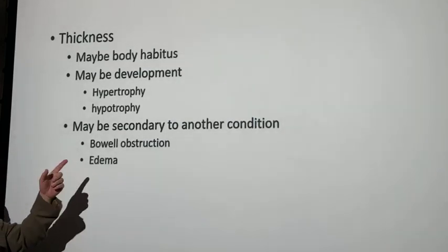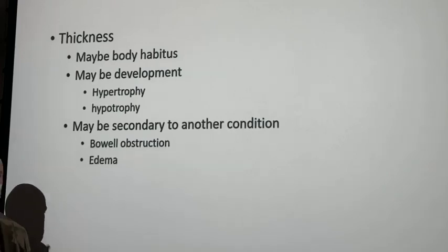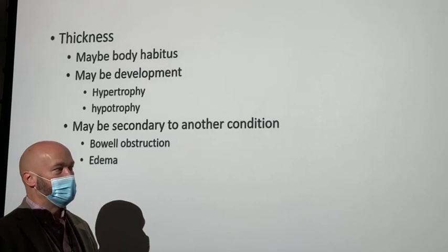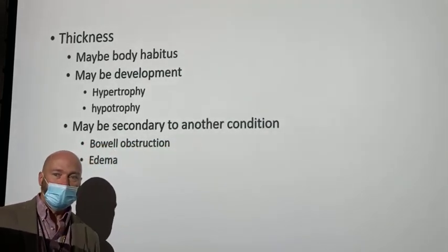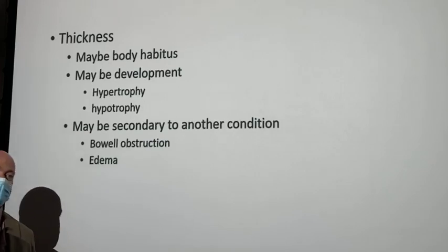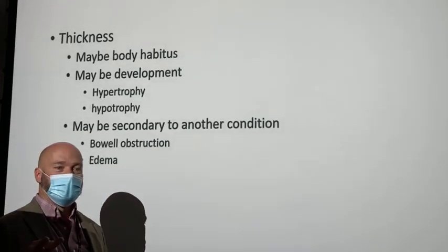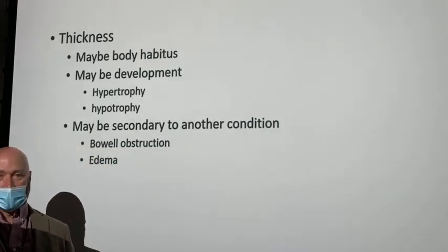But what your real indication is they've got a bowel obstruction is you walk into the patient's room, they've got an NG tube, so they've got a feeding tube in their nose. That's not enough. A lot of people have a feeding tube. Is that NG tube hooked up to suction? That's the second thing you should be looking at. Do they have an NG tube? Is number one. Number two, is it hooked up to suction? That's still not enough. Is that suction canister full of bile?